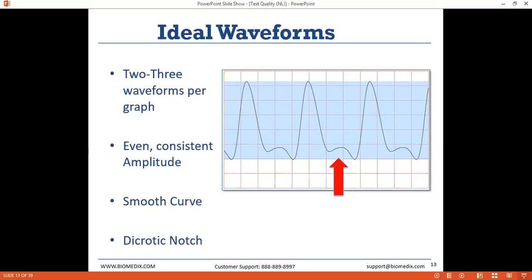What we're actually looking at in these waveforms is literally the artery in the patient's legs expanding and contracting as blood passes through. So on the left-hand side, there's a pulse, a heartbeat, and a rapid expansion of that artery to accommodate the increase in blood flow. That's because these healthy arteries are very elastic, they grow very, very quickly. So that's that steep upslope on the left-hand side. Now, the artery quickly reaches its maximum size. It's quickly expanded to as large as it can get, and then it just as quickly begins to contract. Again, they're very elastic, almost balloon-like in their ability and willingness to expand and contract.